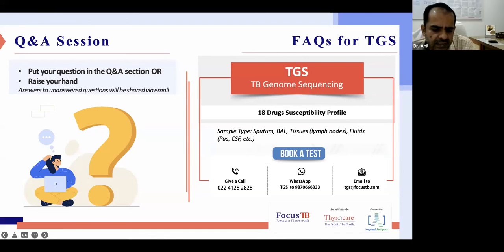WGS is significant for everybody who has TB, irrespective of whether it's HIV, MDR, or XDR. Anybody with TB who you find has a risk factor for MDR, pre-XDR or XDR, such as being a defaulter, a relapse, or a reinfection, you send it for WGS, because we were surprised when we sent the rifampicin resistant isolates for whole genome sequencing. Almost 50% of them, 3 out of 6, came to be pre-XDR. So whole genome sequencing made us realize that we have a problem with pre-XDR in our MDR patients.